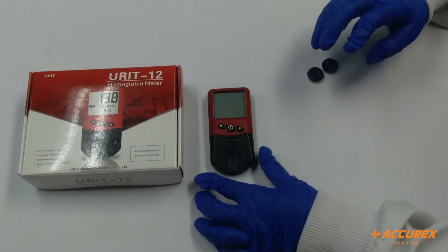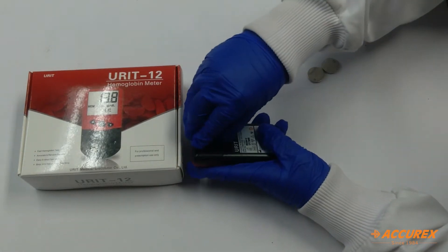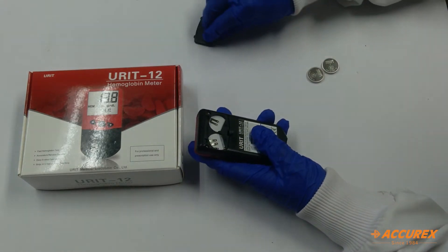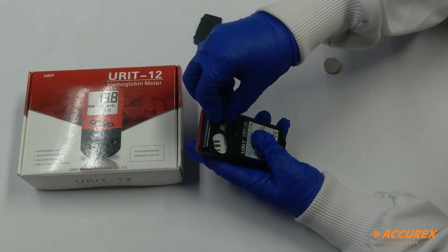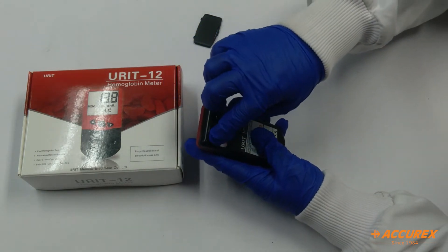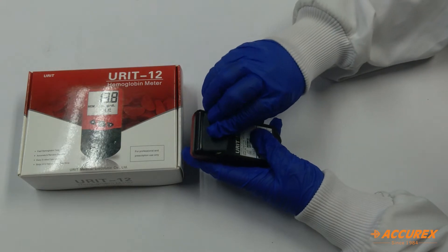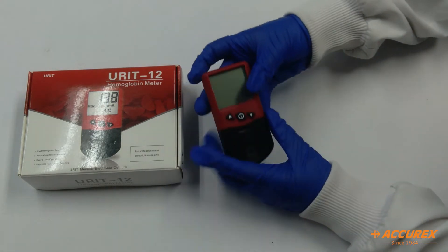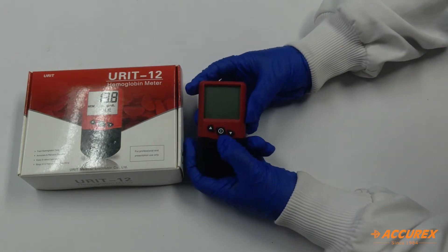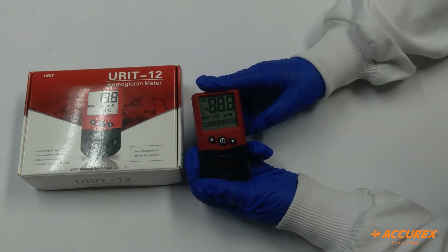Now we will switch on this meter. First we need to insert the lithium batteries. We will insert this battery and then push it, and then we will put the cover. When we click on this button, the meter will start.